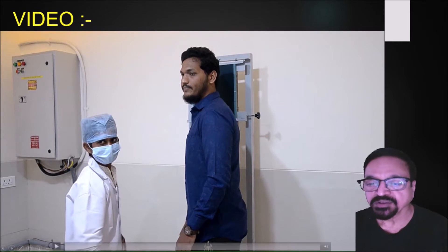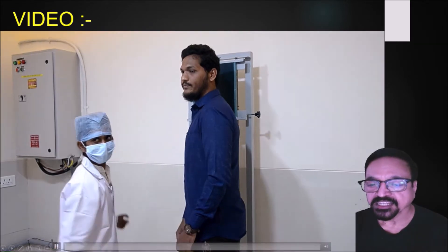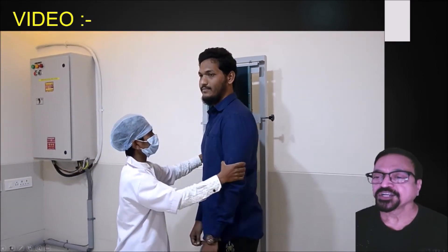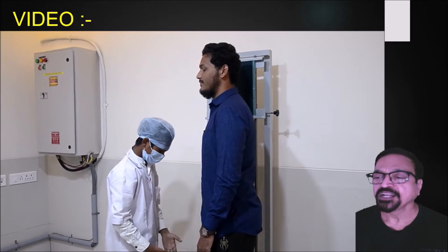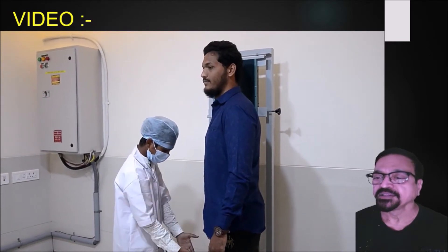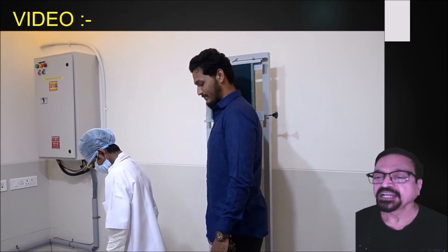Now let's see the standing position. We are going for a cervical spine oblique. The technician gives instructions to the patient, and the patient has been made oblique. It is 45 degrees angulation.